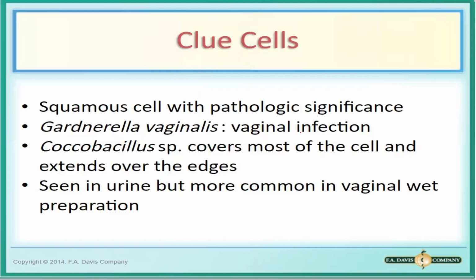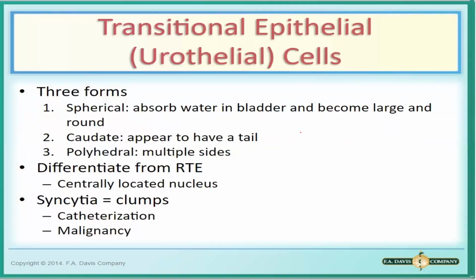Clue cells. Clue cells are squamous cells with pathologic significance. It is because of infection with Gardnerella vaginalis.